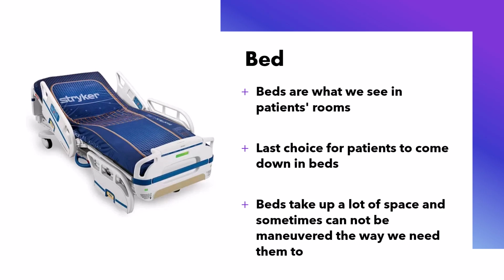A bed is just what it says. And the thing about the beds and the stretchers, they all have controls on them. They may have electronic things that lift them or put them in different positions. And also, they're going to have bed rails that you have to raise and lower. And sometimes they bring a patient down in the bed, not on a gurney, especially if it's a really critical patient.